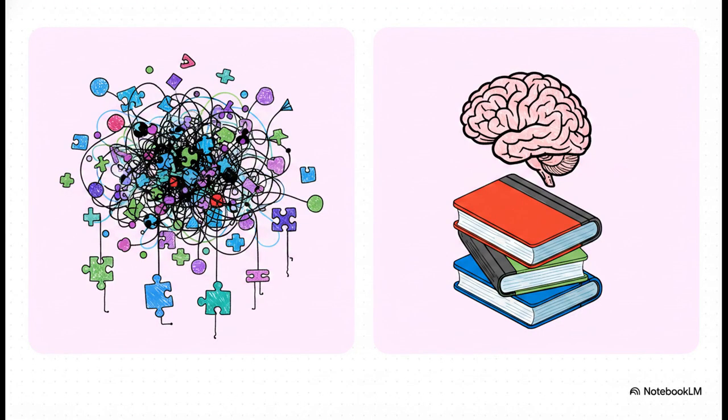Traditionally, we've leaned pretty heavily on exploratory clustering algorithms, a data-driven approach that groups channels based on similarity, which we usually observe during passive stimulation or rest states. But there is a huge scientific drawback to doing it that way. It often produces these sample-specific ROI definitions that are just incredibly difficult to reproduce across different studies.